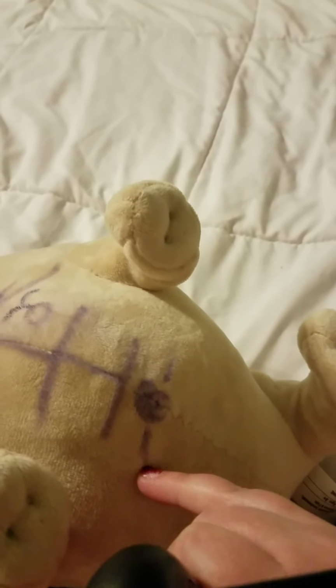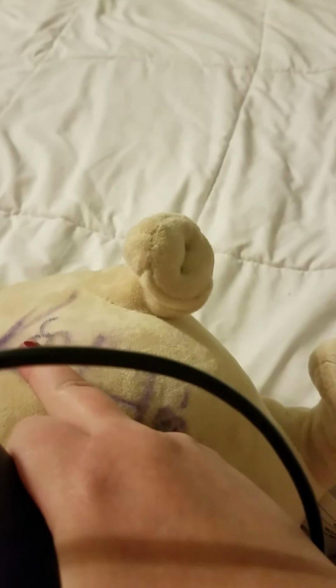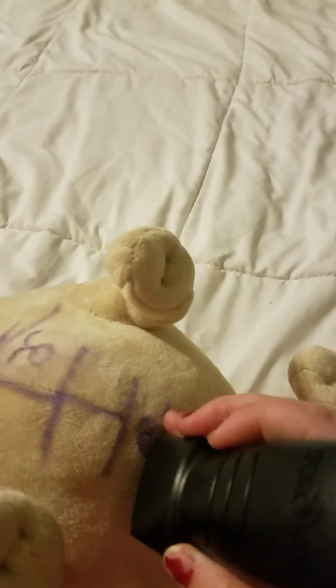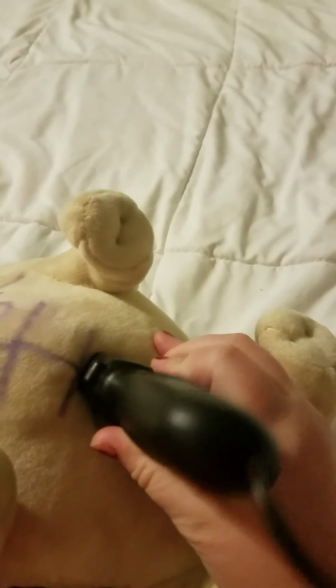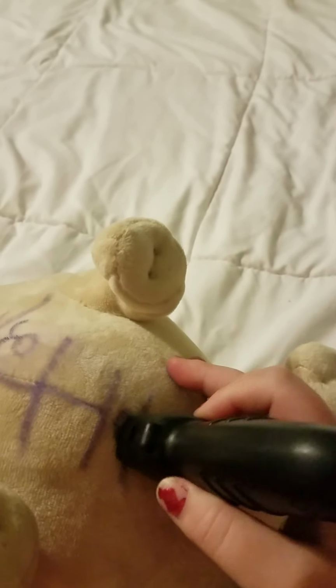They're going to be shooting off from this middle part of your aorta, right through the middle. Notice how this one comes through the top of the aorta. This one comes through the middle. So this will be your left and your right renal arteries. So you're going to take an image of that. And if you can get that in your long, you may be able to see both. And then you're going to run pulse wave through each one of those individually if you have to.